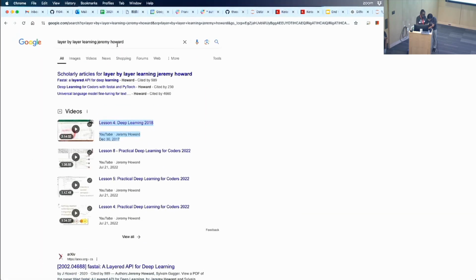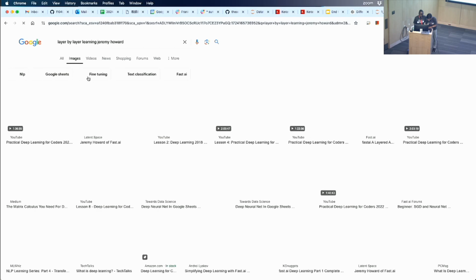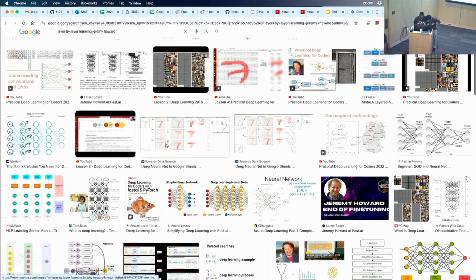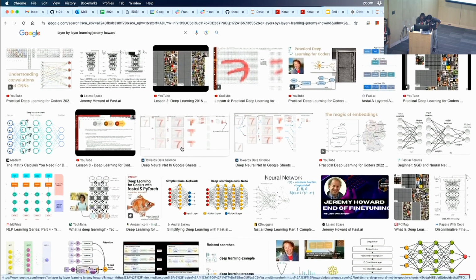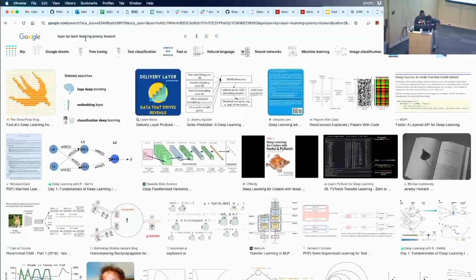we freeze certain layers so that that memory of what a border of something looks like, what is the chest wall, has similar features on an X-ray to this edge, right? A light edge versus a dark edge, just contrast between two groups of pixels, right? And so that's what's in those earlier layers that we're taking advantage of, so the model doesn't have to learn that from scratch.